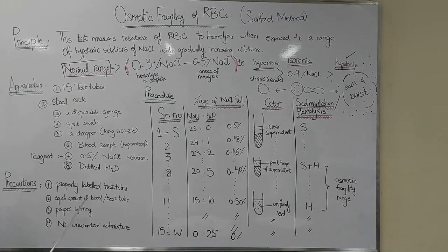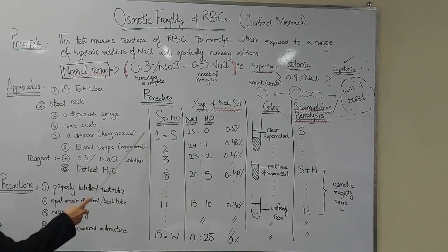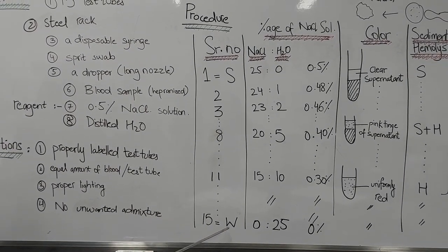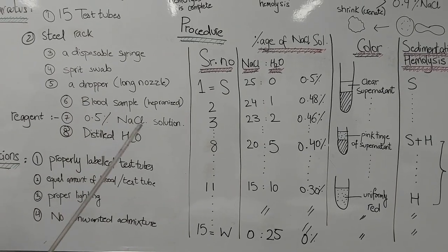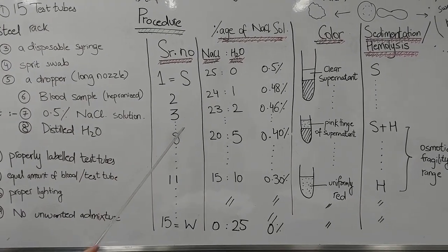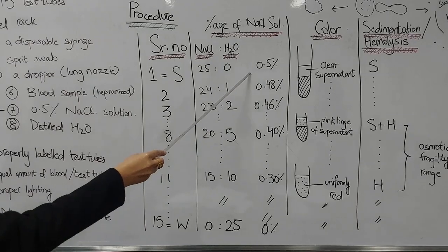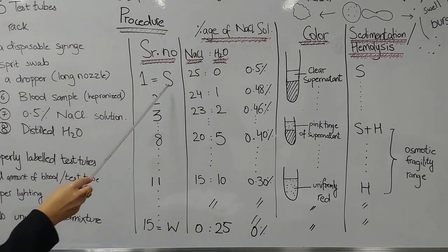The procedure is that we are going to place our clean 15 test tubes in a rack in a row. The first test tube is labelled S and the last, the 15th, is labelled W. We are now going to prepare a range of hypotonic saline solutions. In the first test tube I am going to place 25 drops of 0.5% sodium chloride and no drop of water, giving a concentration of 0.5% sodium chloride — hence it is labelled S.